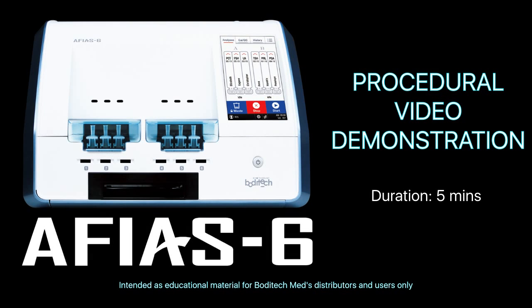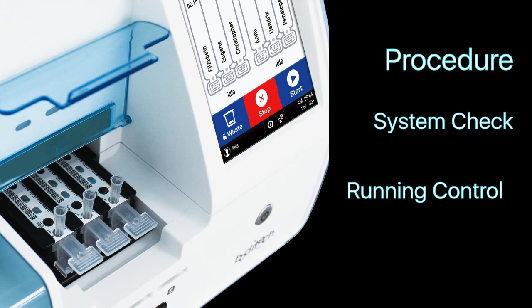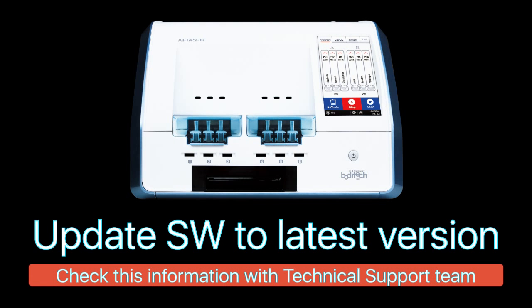This video will demonstrate the procedure on how to run the system check cartridge, two level controls, and two level calibrators in AFIAS-6. It is highly recommended for users to update the reader software to the most recent version available beforehand.